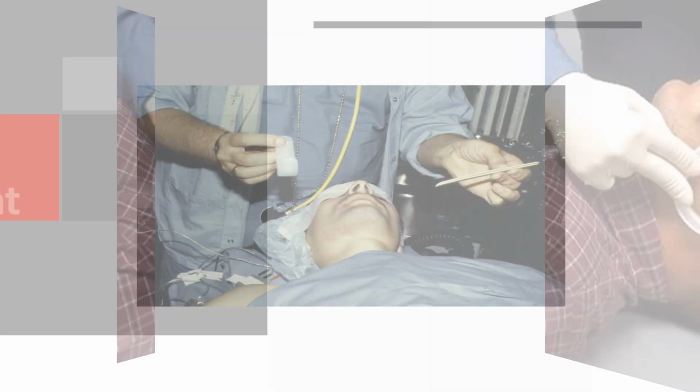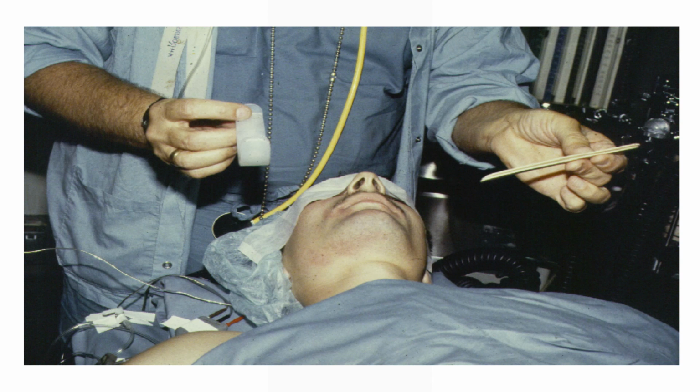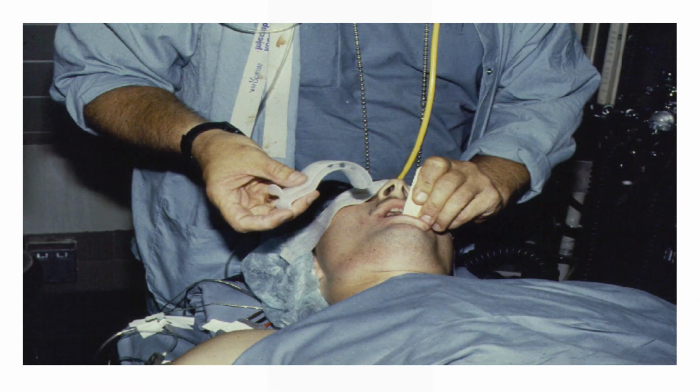Now here's a guy getting ready to put one in. He's got tongue blades, which I agree with. But he's also got the patient's eyes covered because he's going to be working over the face so he doesn't accidentally scrape something. And he's got a rubber tube hanging from his mouth there. That's not for feeding. That actually hooks to a thing called a precordial stethoscope. So he'll put that on the patient afterwards. And then he's opening up and puts that tube right in.